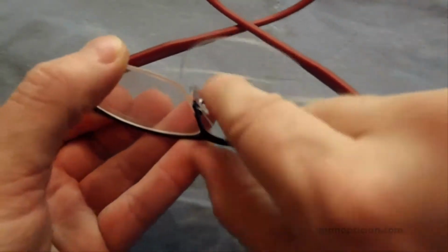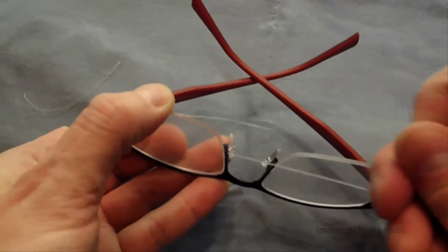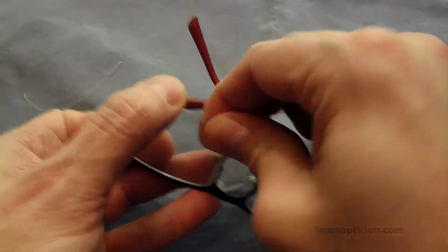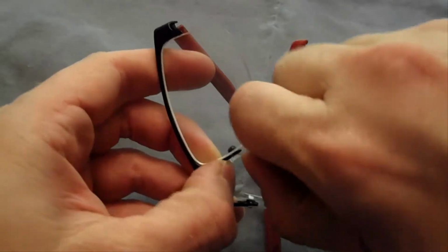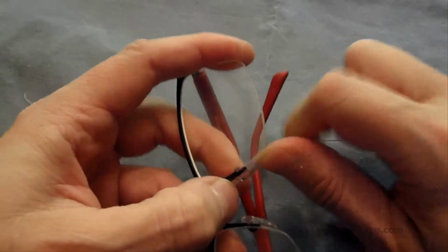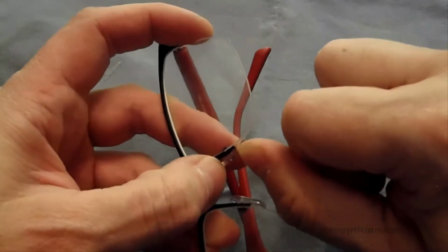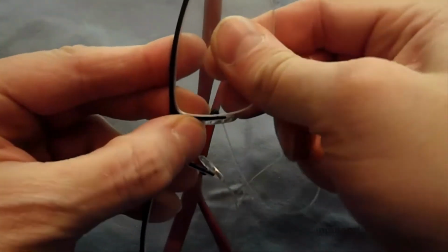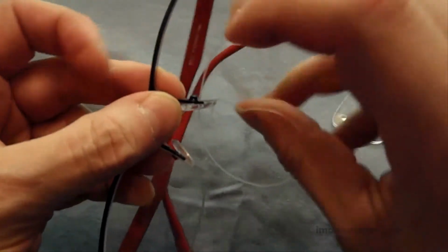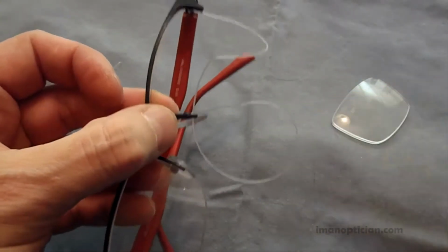Now you've got a lot of excess here, and what you're going to do is just take this and pull it through. Start pulling it, and you'll see how it gets nice and fits right in, and pull it nice and snug there. And then you're going to pull it down and crimp. It crimps right at this location right here on the eye wire, on the new eye wire, and you crimp it down. And then you can pull the lens out, keep it aside, and you can see here how it's crimped, and that's how we know exactly how big this should be.